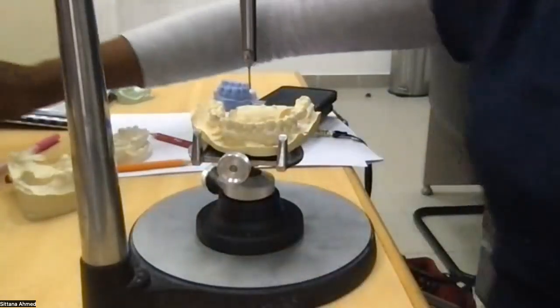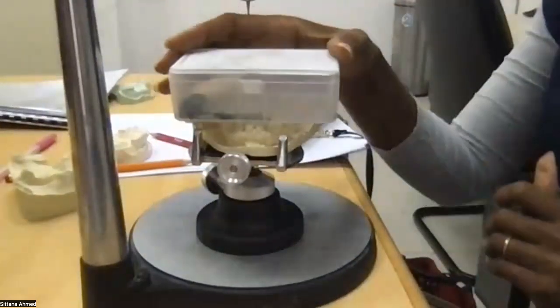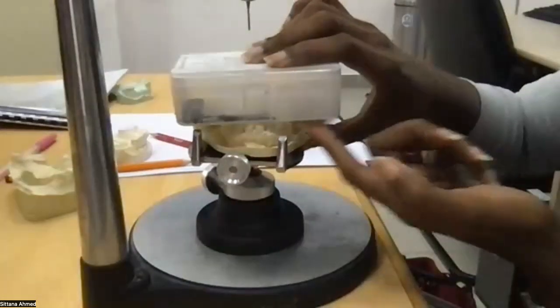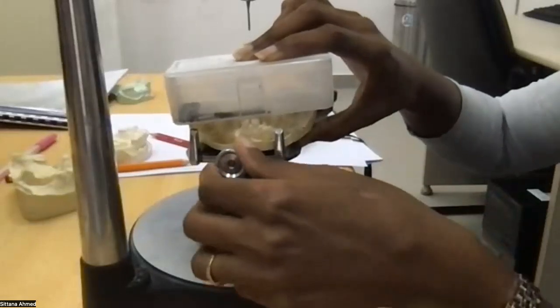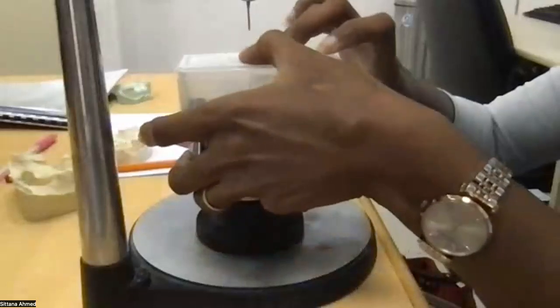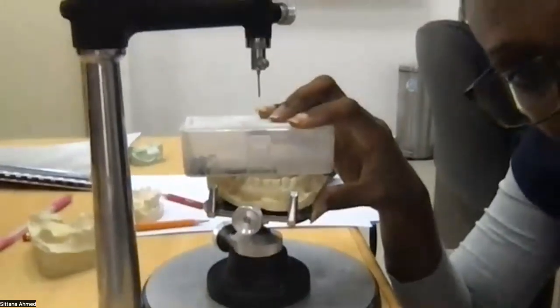If you want, you can put anything on top of the occlusal plane and keep moving it until this surface is parallel to this. That's a much easier way of doing it. So I can tell you that this is parallel. I don't know if it's clear in the camera.